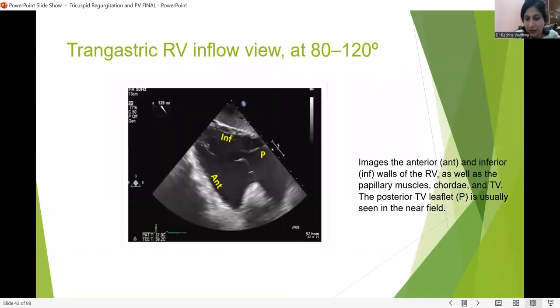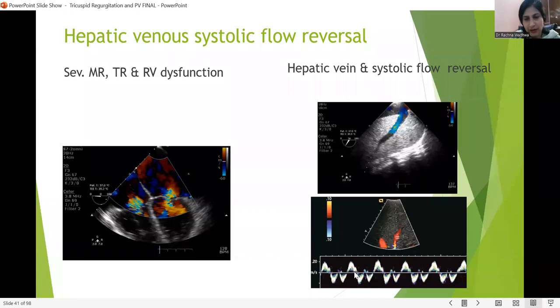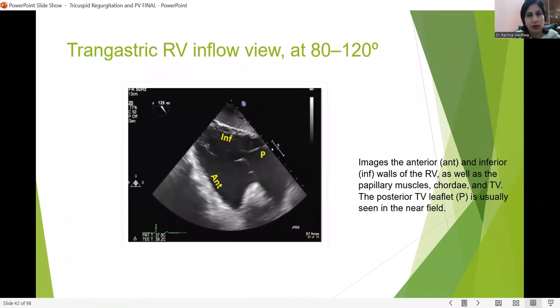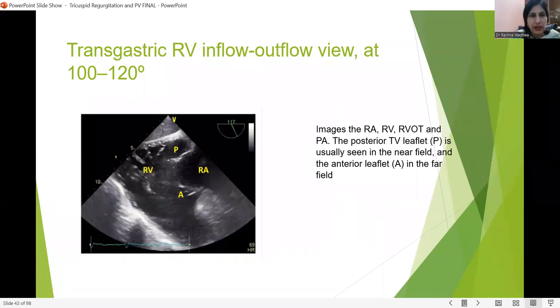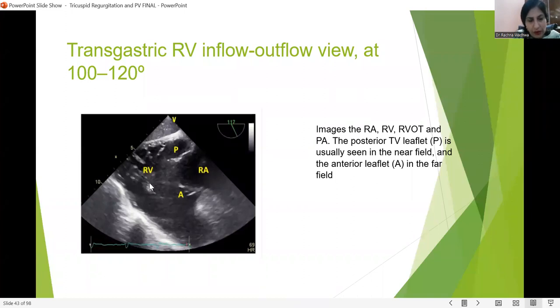Assessment of RV function goes hand in hand with assessment of the tricuspid valve. Another important view is the hepatic venous assessment — IVC diameter, RV function, and hepatic venous pulse wave Doppler are very important, because systolic blunting or systolic reversal indicates severe TR. The transgastric view shows the inferior wall, anterior wall, and the posterior cusp. Increasing the angle to 100–120 degrees reveals the posterior and anterior cusps clearly, with the right atrium and right ventricle and their movements visible.